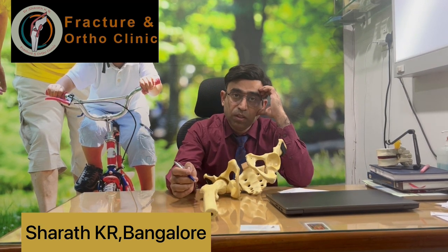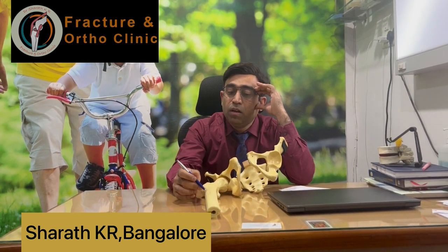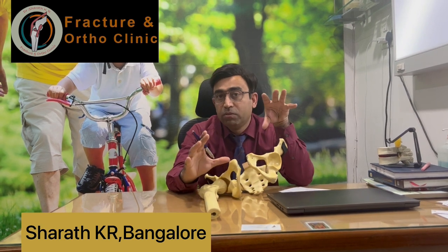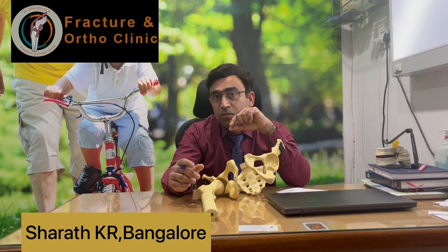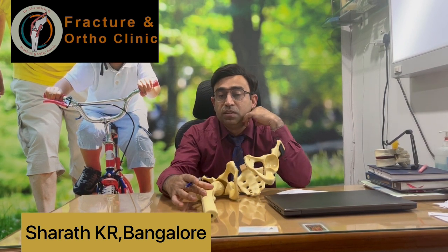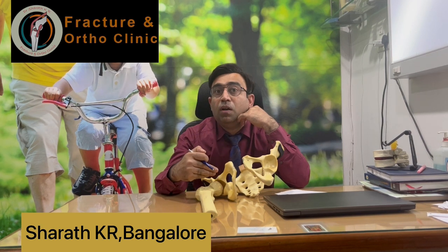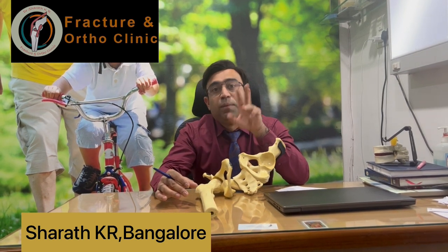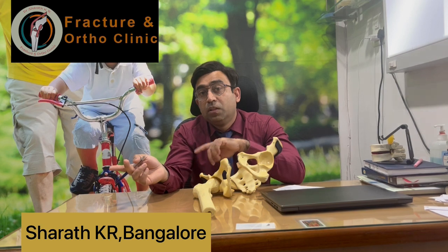One is that it has a steep learning curve, meaning the surgeon has to go through specific training and then do it. Not all patients are suitable for this procedure, because hip replacement is done for a variety of reasons. Some particular causes are not suitable for this approach, and if there are any complications of hip replacement, like fractures of the femur, thigh bone, or acetabulum, this approach is not suitable to go through a second time. Meaning, if there is any problem, again the approach will be from the posterior, not from the front.